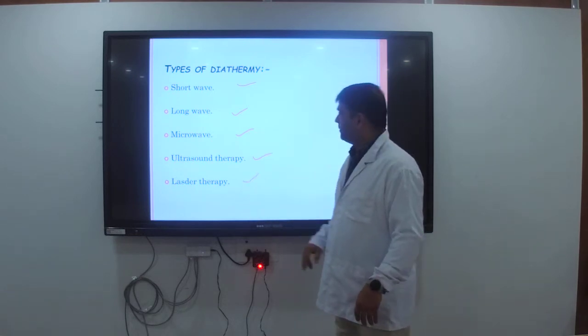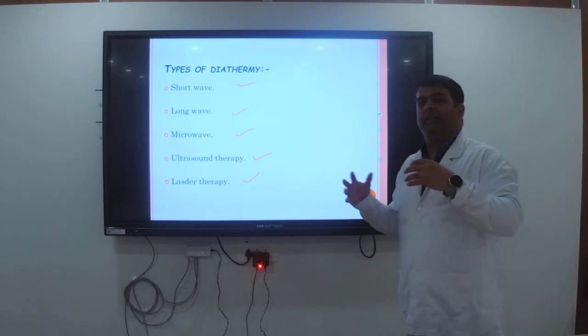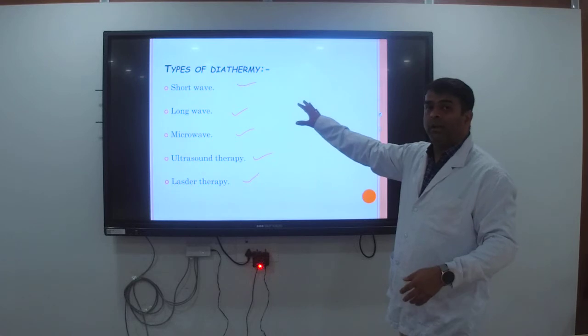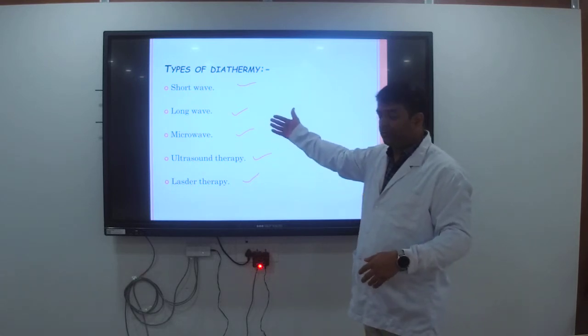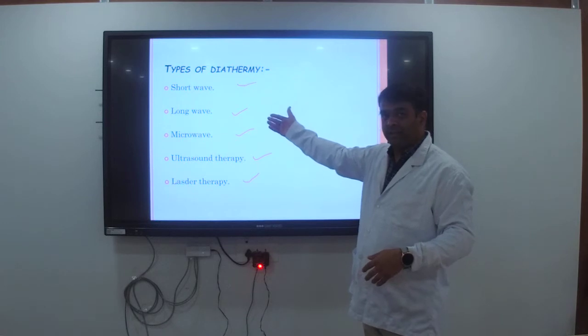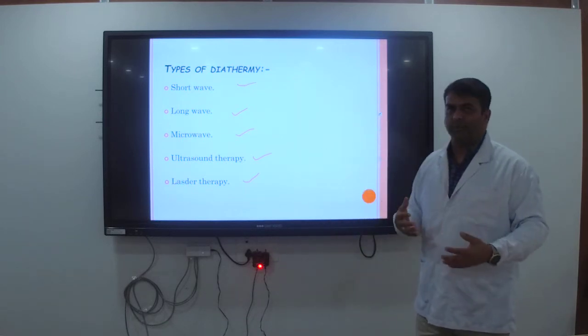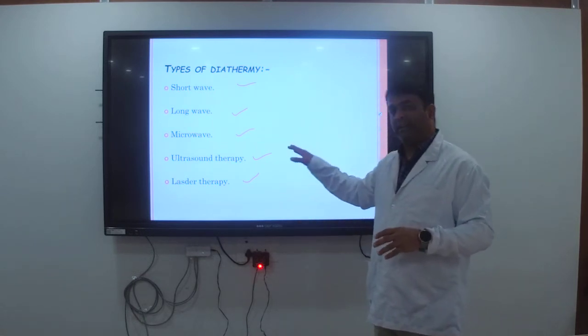Okay, here now we will be talking in a detailed manner about shortwave diathermy, but there are other distinct categories, longwave diathermy and microwave diathermy. These two are not in use as much as shortwave diathermy.